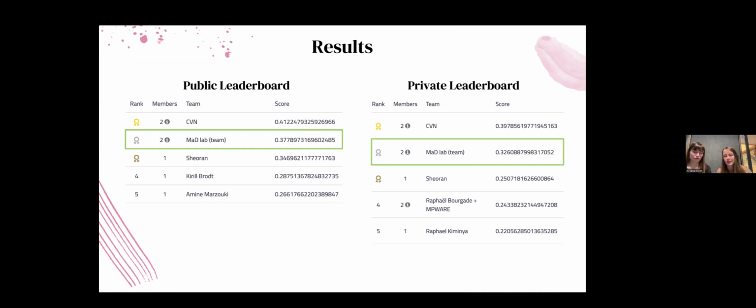So what we reached, I think, was still, if we compare to the random score, the random would be, I think, if I remember correctly, around 0.07, something like this. So it's much higher than random, but still not good enough for a clinical setting. The goal would be to discuss with pathologists and to see how we could improve this to make it usable. I was just wondering if you measured also some other quality indicators like sensitivity or specificity.